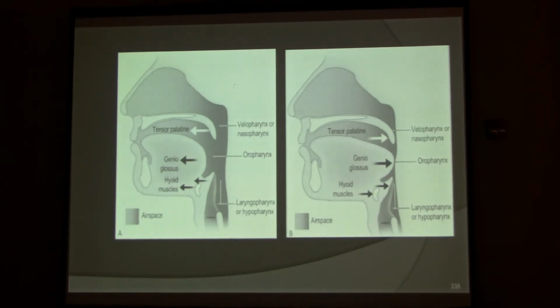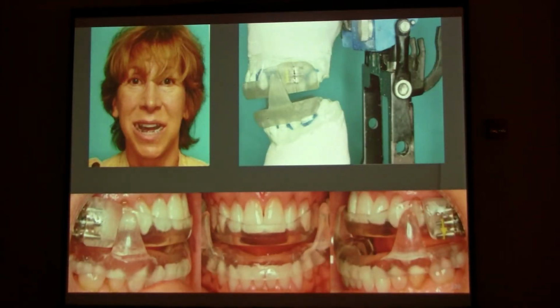Compliance with the mandibular posture device is all of the 8 hours. It'll match it or beat it. And so from mild to moderate apnea, that mandibular posturing device is a very effective appliance and an alternative to CPAP. The gold standard is still polysomnogram, and so it's useful to get a study done where you measure the oxygen saturation.